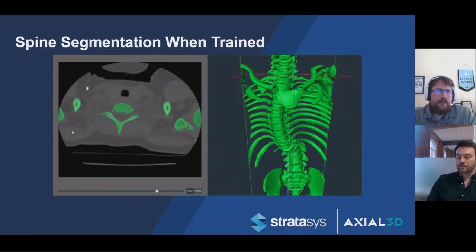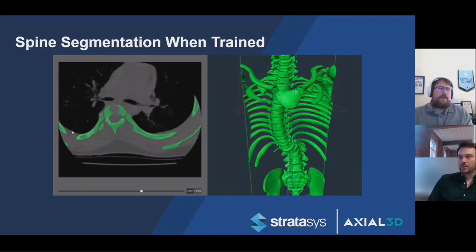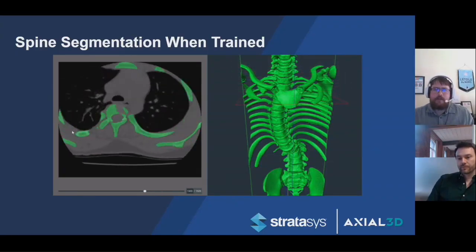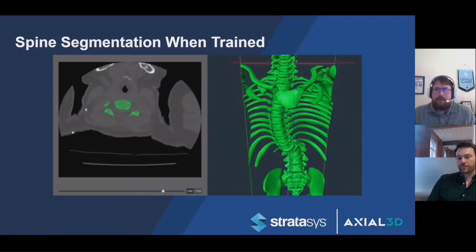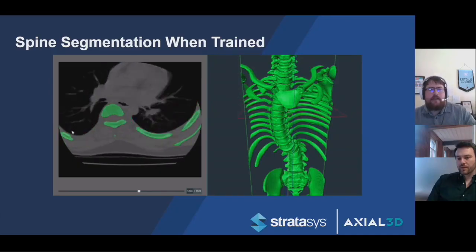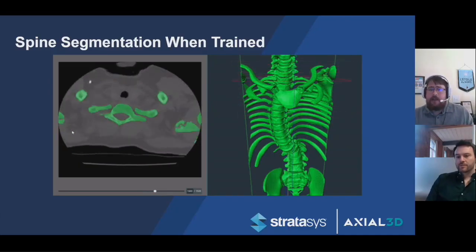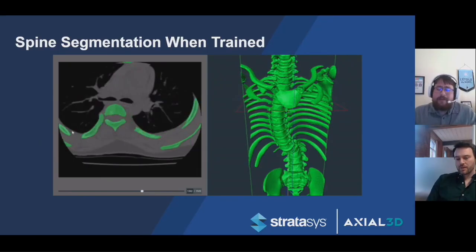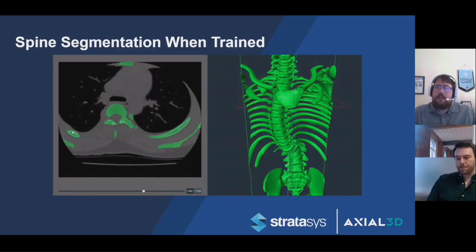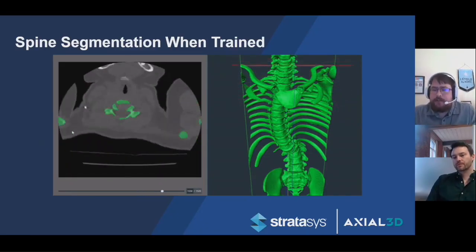For sure. And I think, kind of going back in our conversation a little bit, being able to take that 2D data, make it 3D so that the clinician can better understand how to treat a patient, is easily going to give the patient a better outcome. But at the end of the day, making that process automated has even more power, because it seems like there's a lot of time that's involved in segmentation until you bring machine learning and automation into that process.